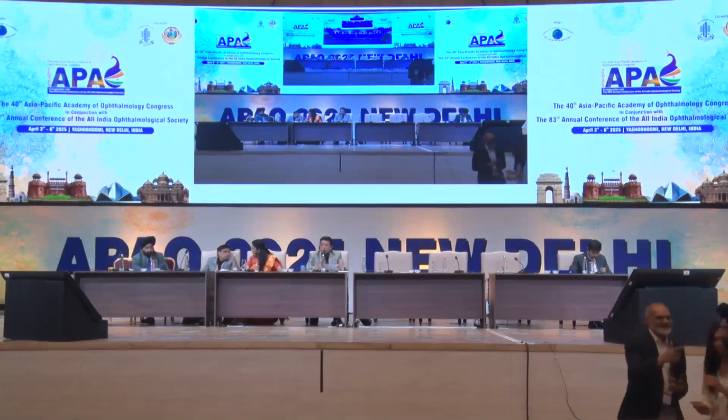To this session on cataract panorama. It's going to be a highly interactive, practically oriented session. Basically, just a series of videos, and we have a very distinguished set of panelists who will be taking you through how to manage each and every situation. Interaction is always welcome. Any inputs from each of you would be most appropriate.